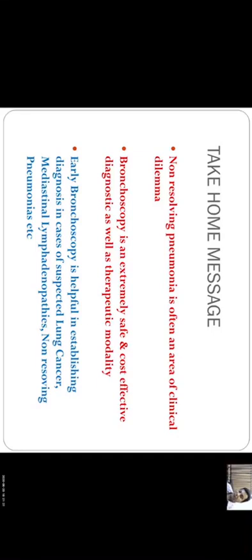Therapeutic because even with a conventional bronchoscope, many times you can take out foreign bodies, and in patients admitted in the ICU who have lung collapse because of secretions, you can take out those secretions, which leads to proper aeration of the affected segment or lobe. Also, early bronchoscopy is quite helpful in establishing diagnosis in cases of suspected lung cancer, mediastinal lymphadenopathies, and non-resolving pneumonias. Thank you so much.